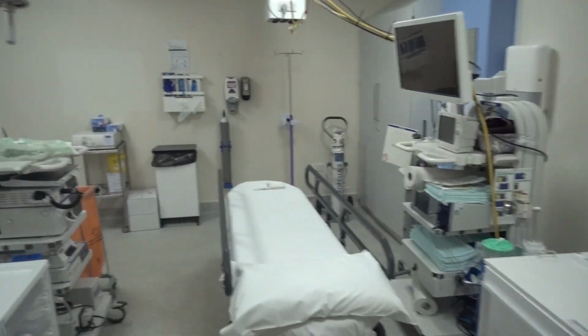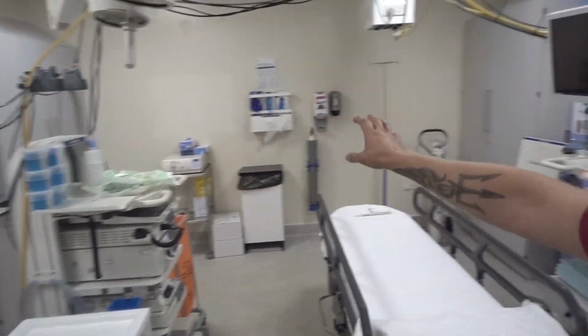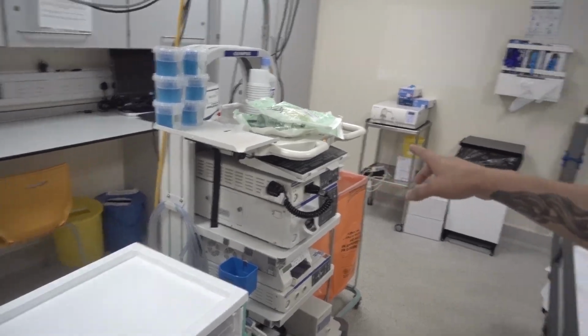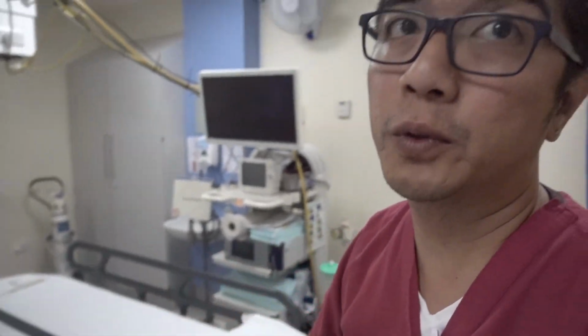So here we are. Patients come in and we've got our endoscopy stacks. We've got the screen there. This is where we connect the scope. That's where the patient lies down for their procedure. Before we start the procedure, room nurses do basic checks, do the WHO check to make sure that we have got the right patient and the right details of the patient. So that's the third step. Patients go in here for their procedure, and let's go check out what the fourth step is.